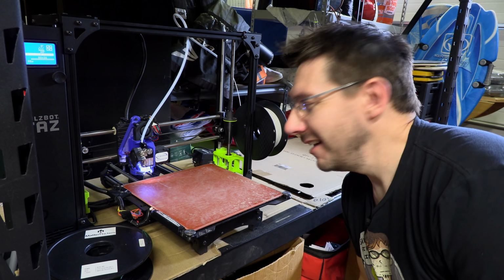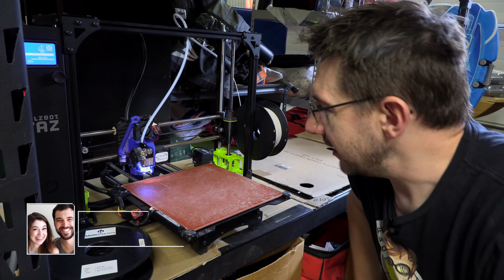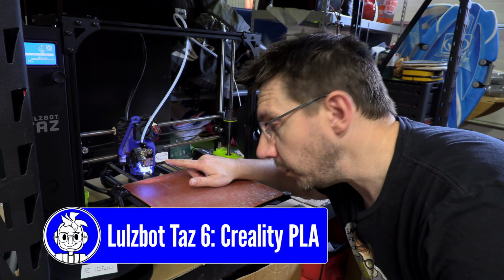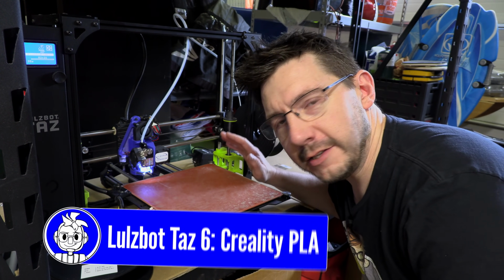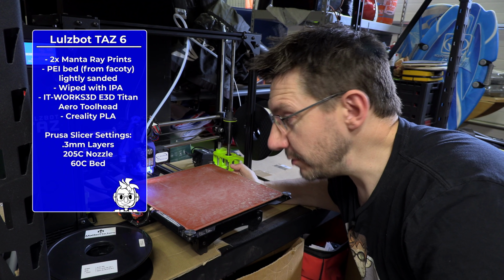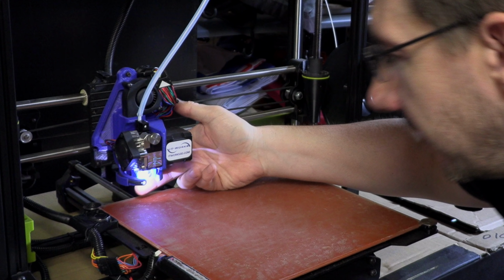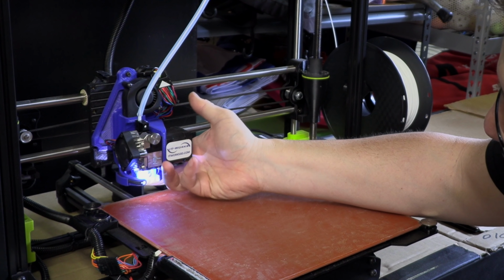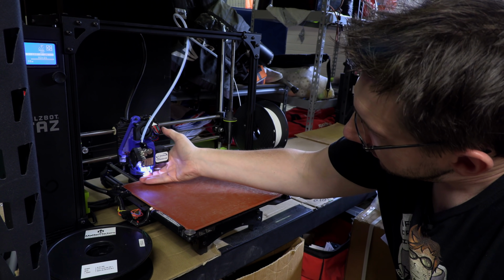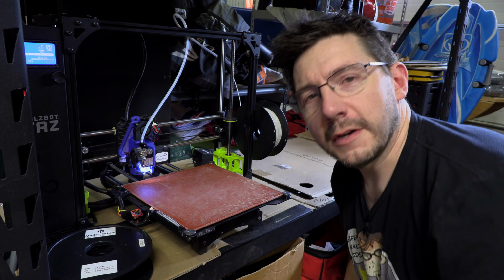Ha, the TAZ 6. I saw Evan and Caitlin just tweeted about this recently, and I was like, yo, TAZ 6 buddies, this is the TAZ 6, and it works great. I still love this machine. It's got an ItWorks 3D 1.75 millimeter tool head on there, and it's got a hardened steel nozzle. Since the TAZ 6 uses these four metal washers to do the bed leveling, the electricity doesn't flow through that hardened steel as easily. And also, there's a little piece of filament that kind of oozed out at the end. So I kind of, there we go, got it off. There it is. Since the nozzle has to touch this, it has to be clear.